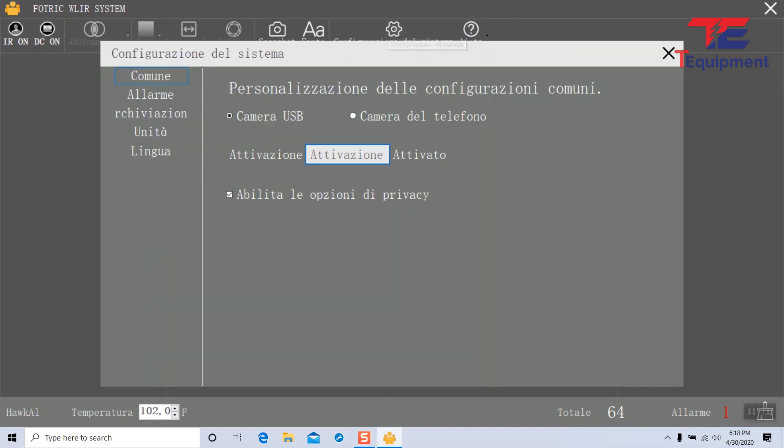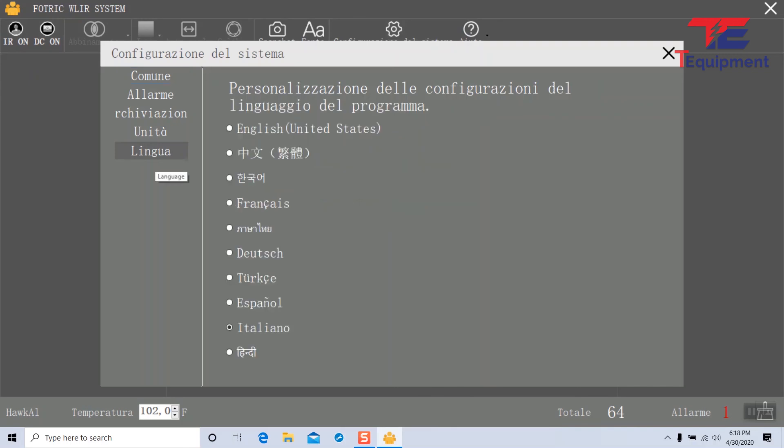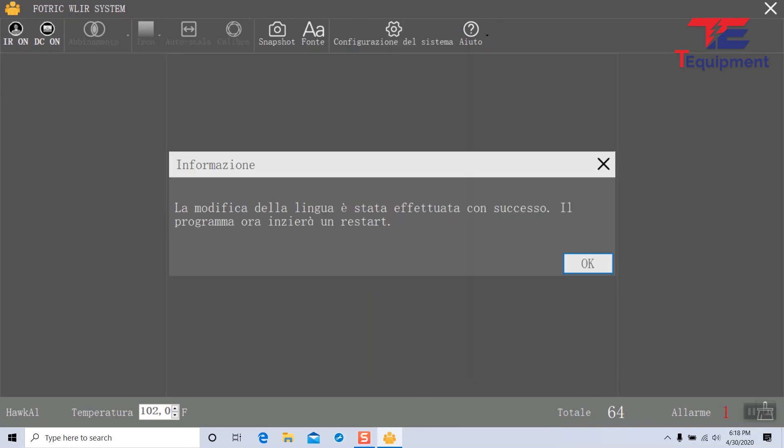I'm going to go back into the system, go back to languages, set it back to English, and close this again.